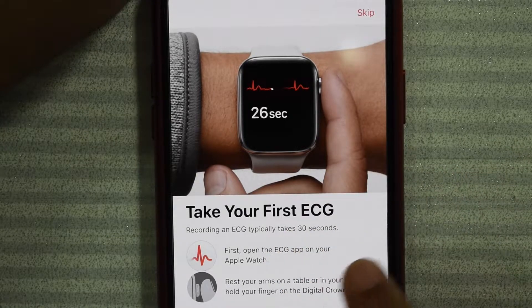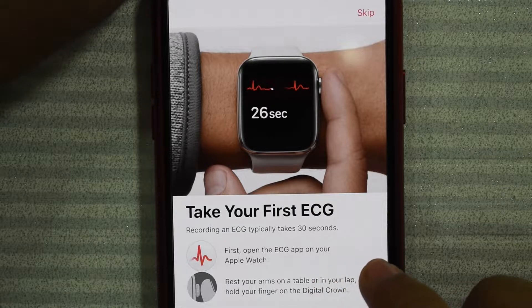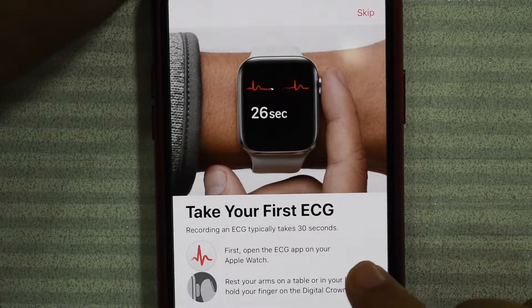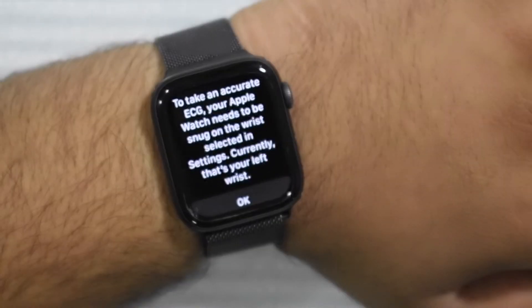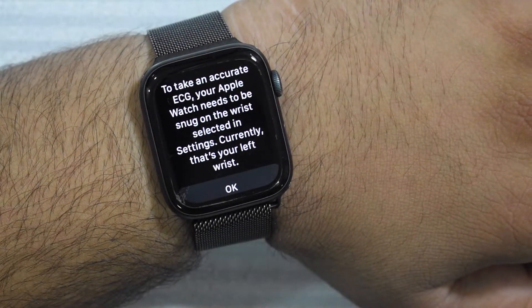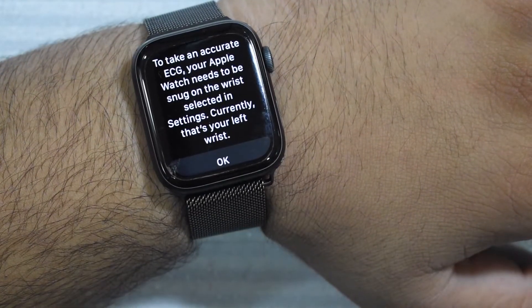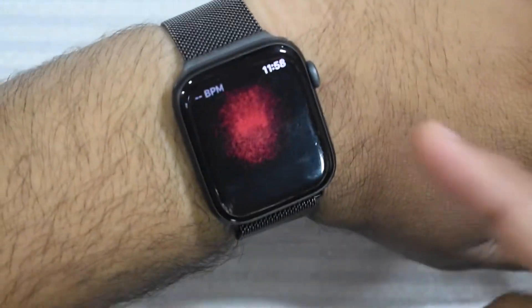Try your first ECG recording. ECG takes 30 seconds. Open the ECG app on your Apple Watch, rest your arms on a table or in your lap, and hold your finger on the digital crown. To take an accurate ECG, your Apple Watch needs to be snug on the wrist selected in settings — currently that's your left wrist. That is correct — it is snug on my wrist.